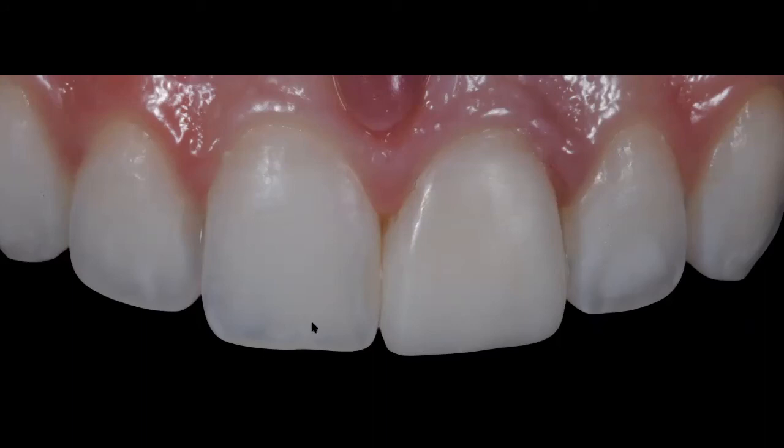Now we have to reproduce it. We've got to make sure that we get all these intrinsic effects in our final restoration. So the first thing that I did is that when I built up my temporary, I chose a very light composite, a bleach shade composite.